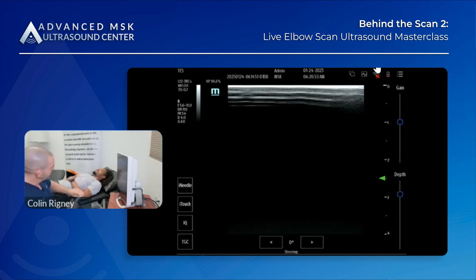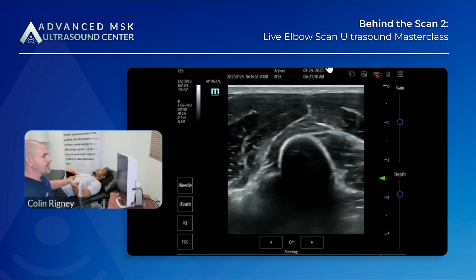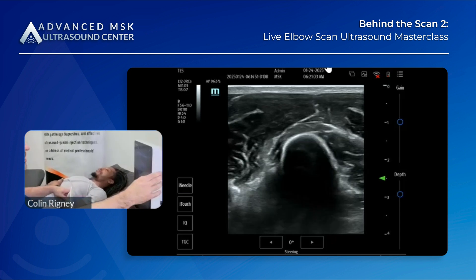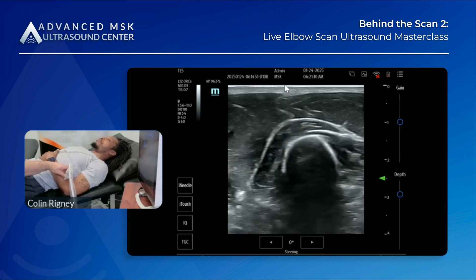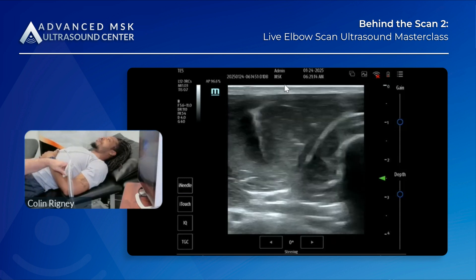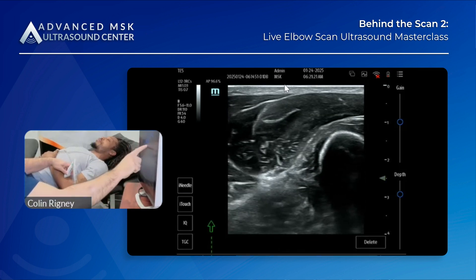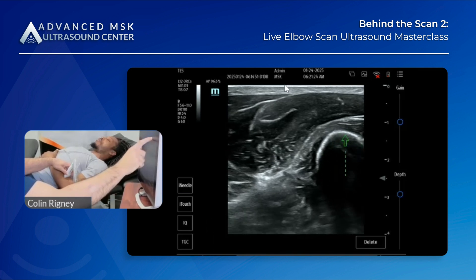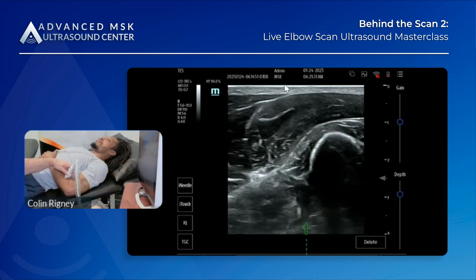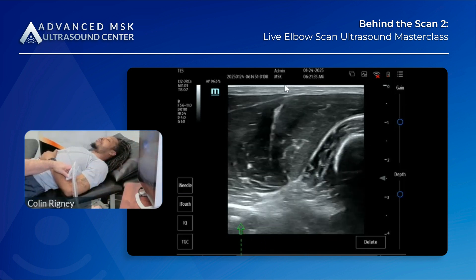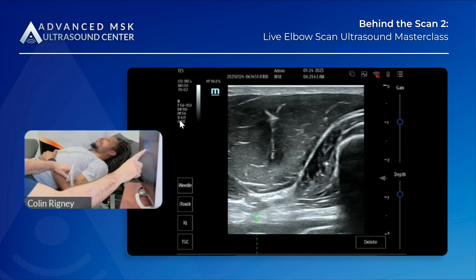To acquire the lateral window, start a little further distal on the forearm. In short axis you can see the bone right in the middle — that's the radius. Move upward, superior and proximal, and that's the supinator. In short axis, adjacent to it is all brachioradialis up here. Now move proximally just ever so slightly and boom — you see this bright structure come in on the bottom. That's our bicep brachii.